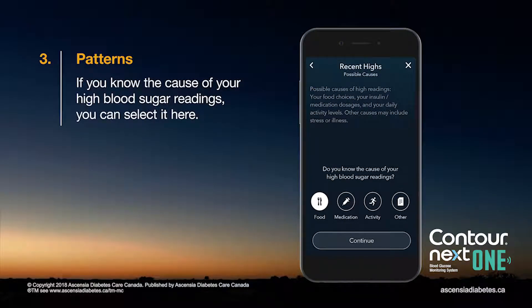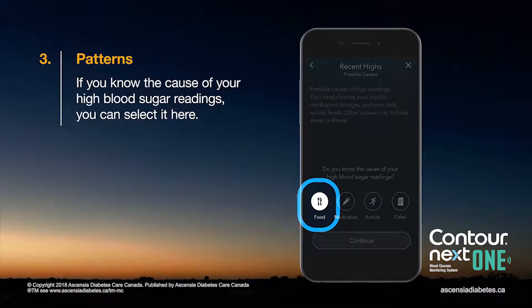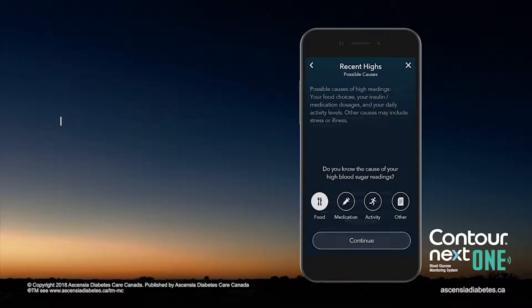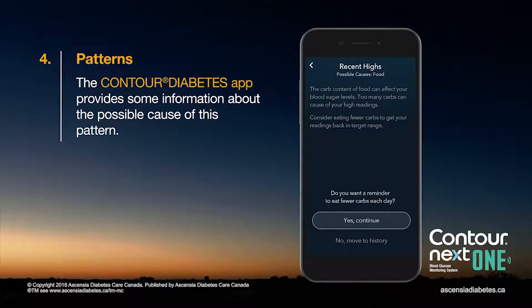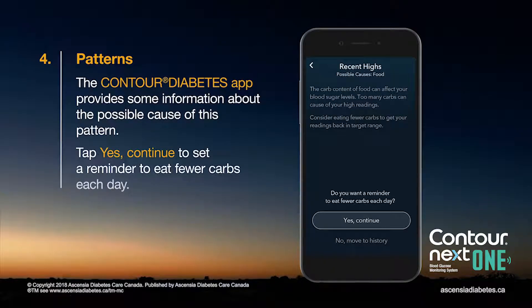If you know the cause of your high blood sugar readings, you can select it here. The Contour Diabetes app provides some information about the possible cause of this pattern.